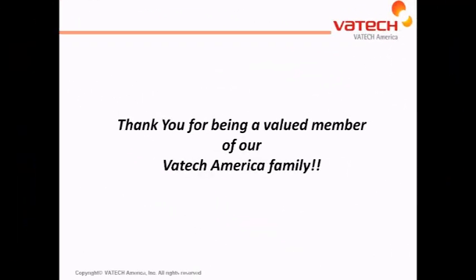This concludes our video presentation to acquire a full panorama image using the PaX-i 3D system in a real-time environment.